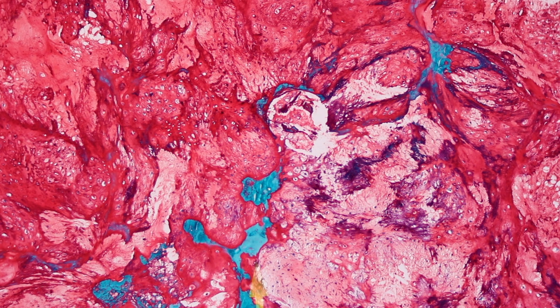So I like to see more than just one focus where bone is completely surrounded by cartilage. And if it's a curettage or an open biopsy or something like that, my expectation is I'm going to see it in scattered multiple places.